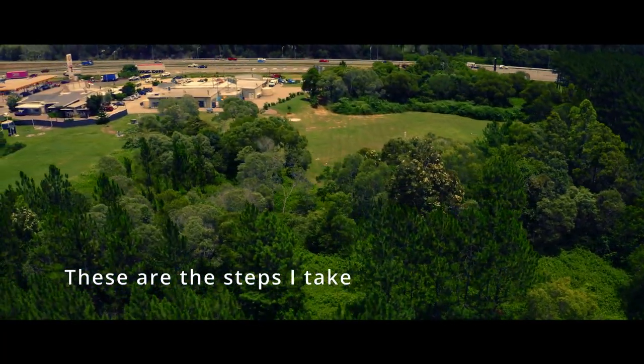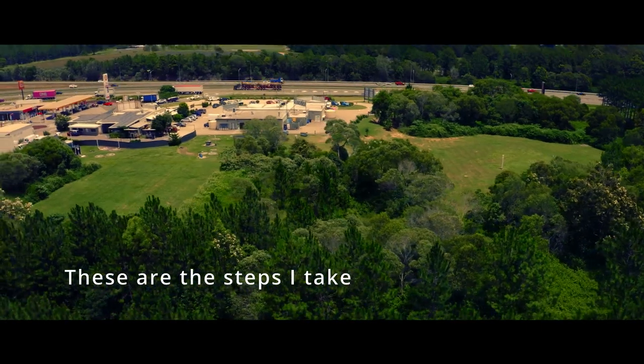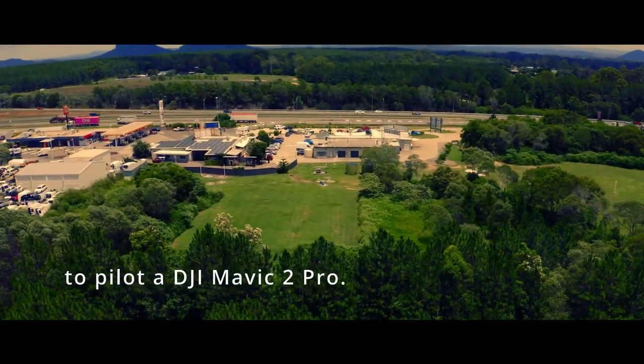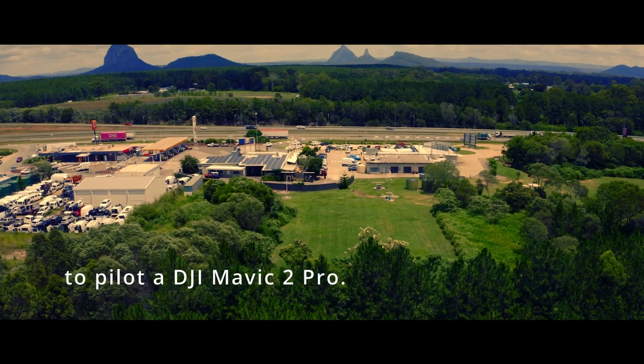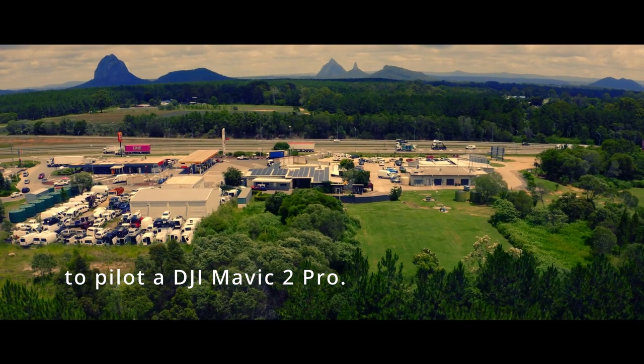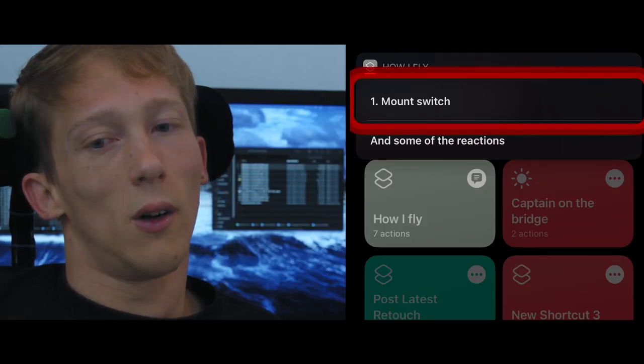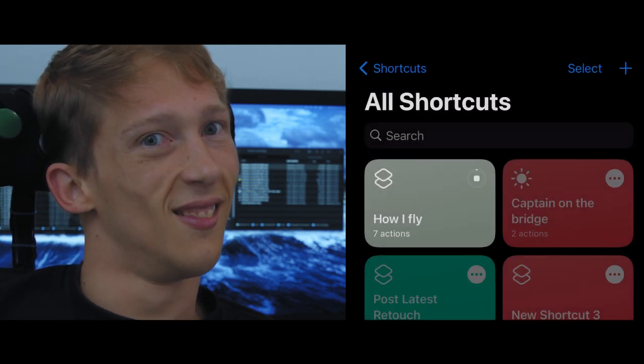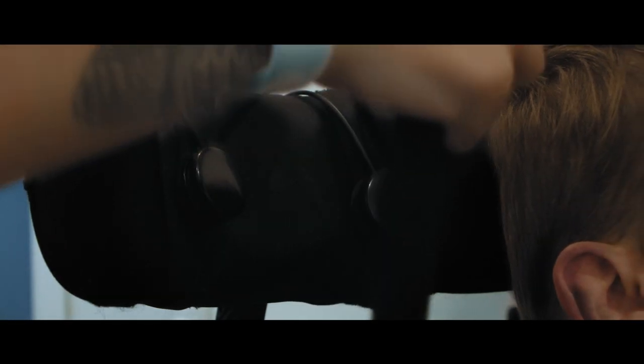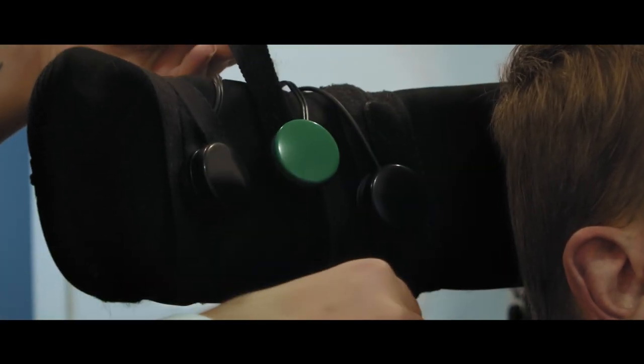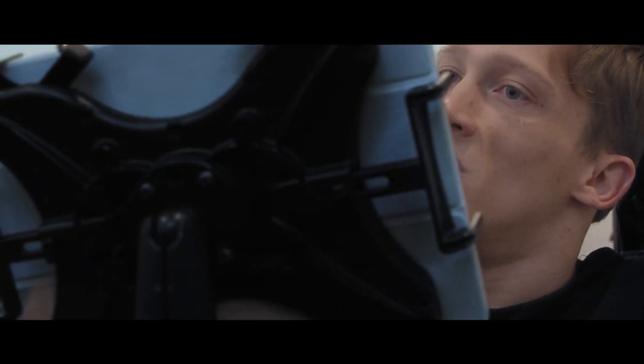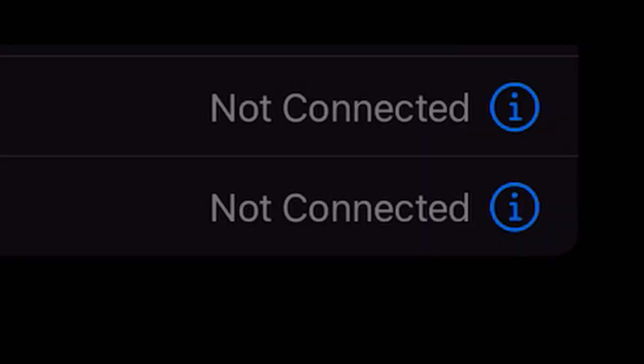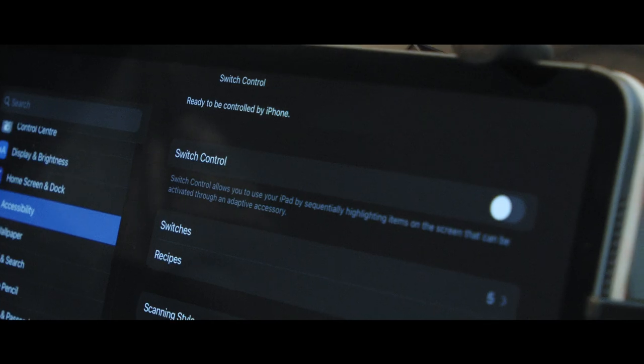1. Mount switch on wheelchair headrest and connect to a Bluetooth switch interface to pair the switch and under accessibility settings on iPad set up switch control.